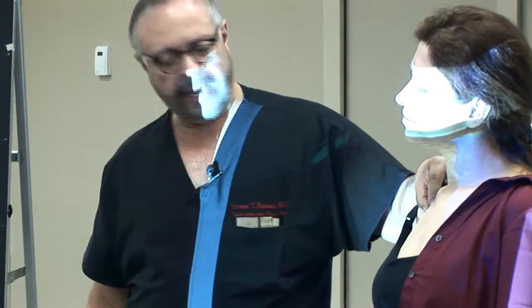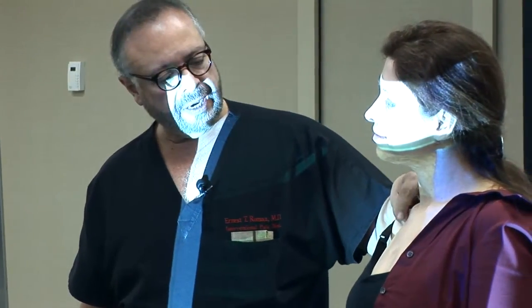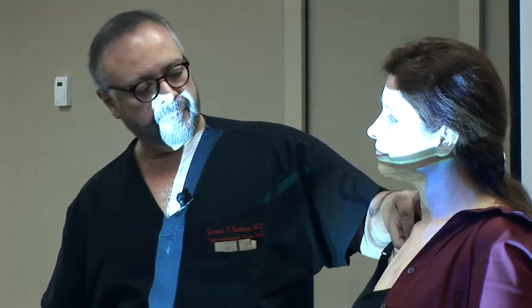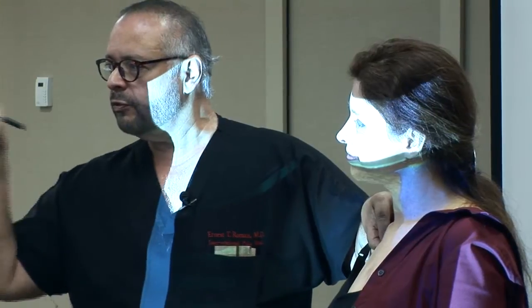What I'm going to do is use my fingers — my thumb is going to sit at the medial border of the humeral head, my other finger at the coracoid process. I'm going to apply pressure — up and down, pressure and releasing — just like this. I'm trying to distract her mind. I also keep my needle hidden so she won't see it coming.